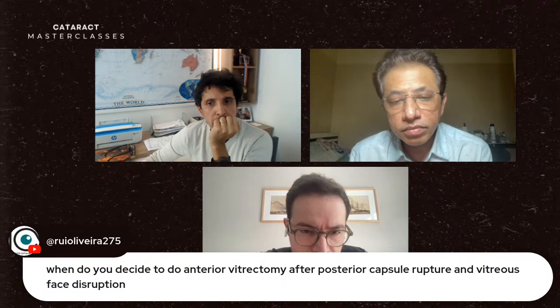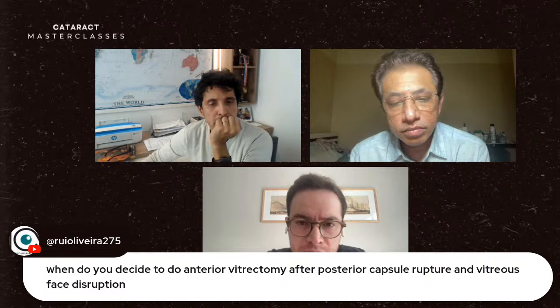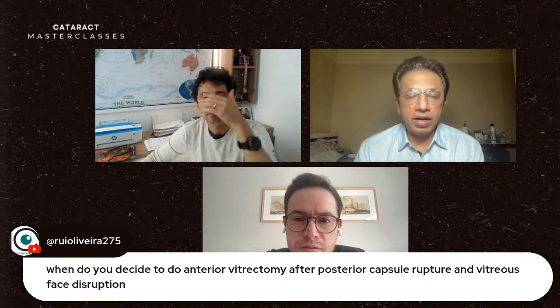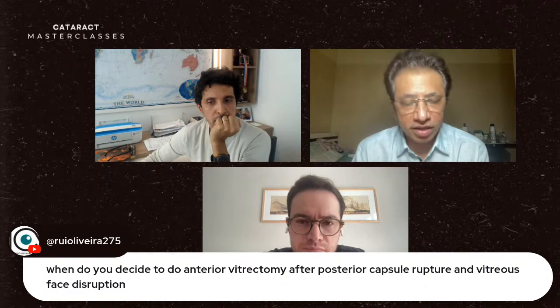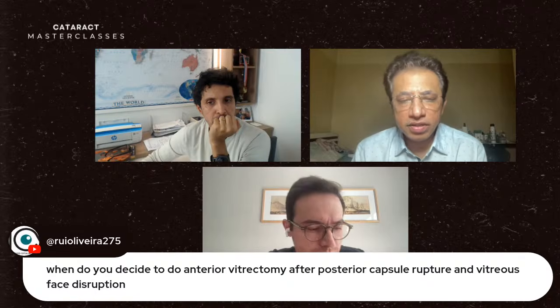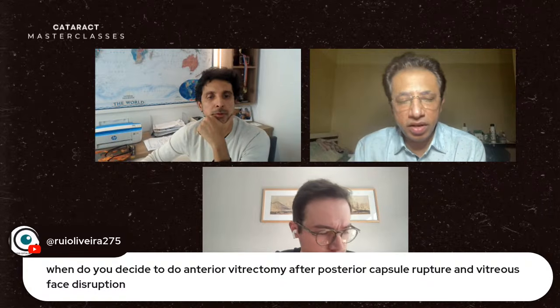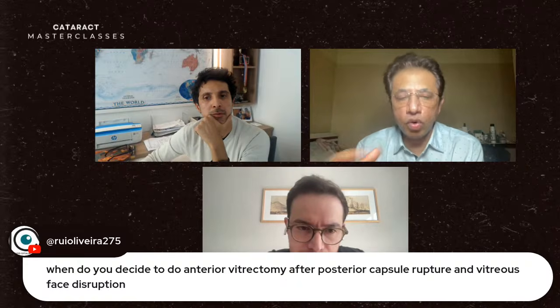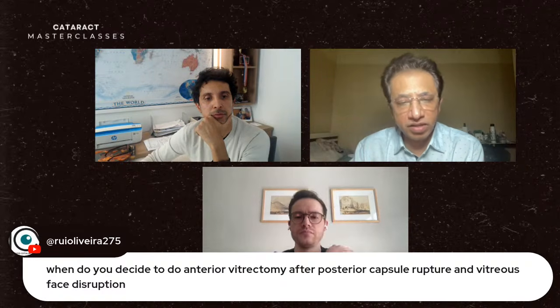When do you decide to do anterior vitrectomy after posterior capsule rupture and vitreous face disruption? If the anterior hyaloid face is ruptured and vitreous is prolapsed, you have to do vitrectomy. There is nothing like you can get away with that. If the anterior hyaloid is breached, then you have to do vitrectomy. There is no second thought. Only in the situation where the anterior hyaloid is intact, you can go ahead and place the lens inside without doing a vitrectomy. That's the idea of identifying this.